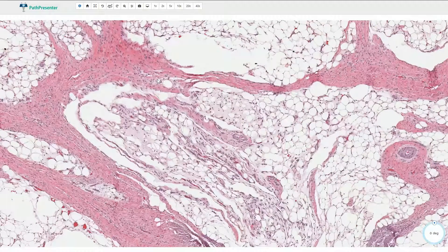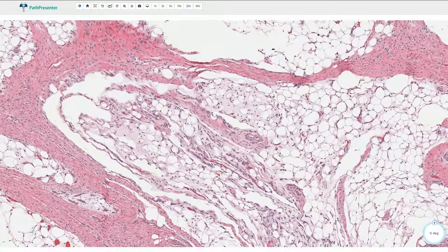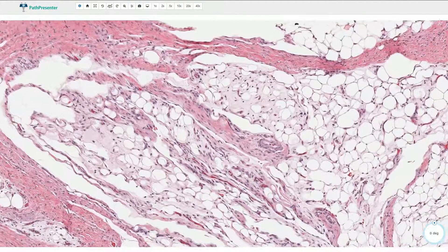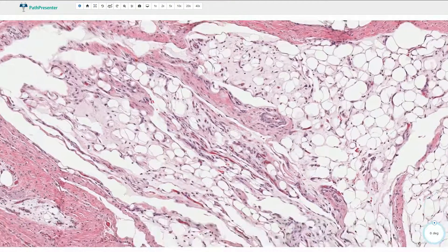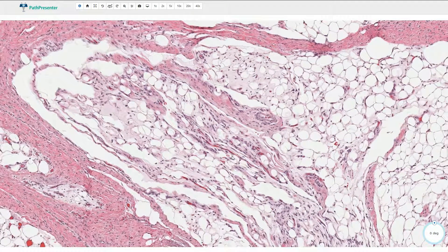So to summarize: uneven fibrous septae and lobules with mature adipocytes, areas of myxoid appearance, and some immature lipoblasts.